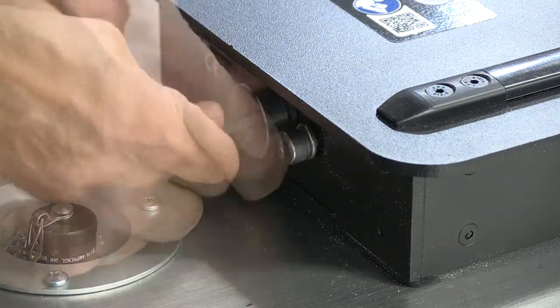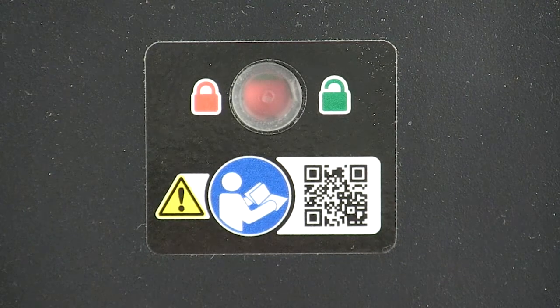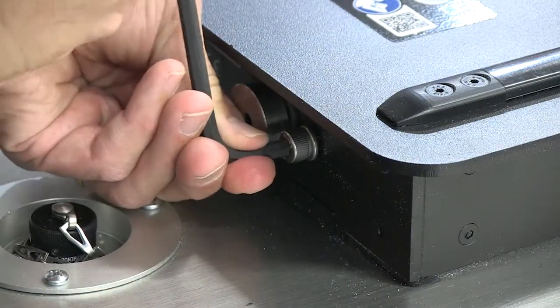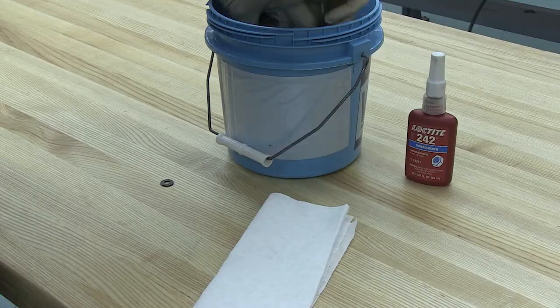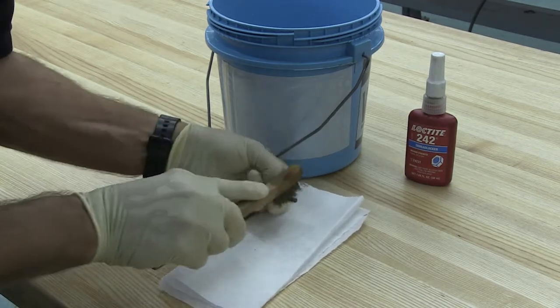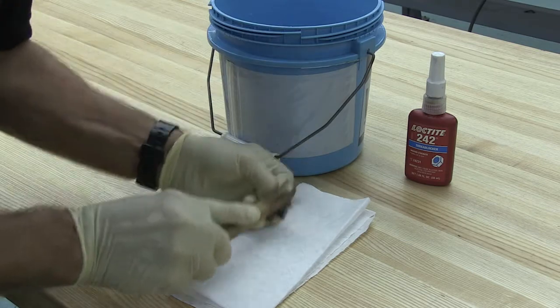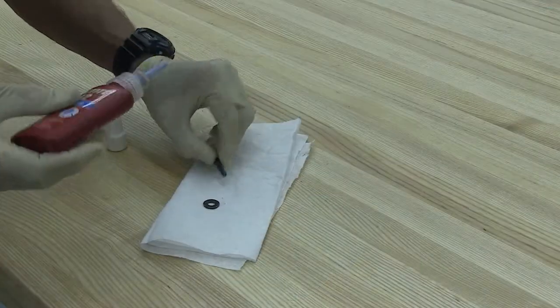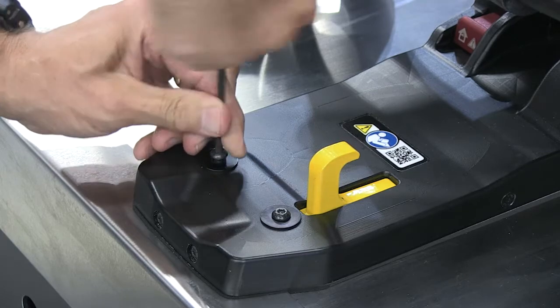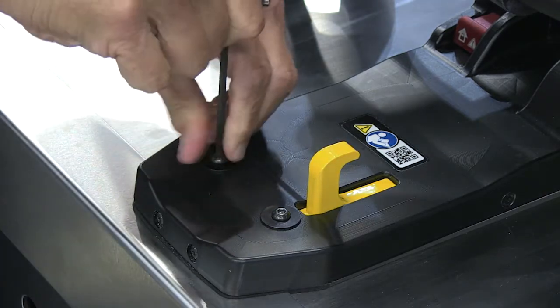Use a 6mm Allen wrench to tighten the fastening bolt. Verify the floor lock indicator window changes from green, unlocked, to fully red, locked. Use the 6mm Allen wrench to tighten the set screw until snug. Clean and prepare the two 4mm nose screws by cleaning their threads and the mating threads of the safety hook mounting block with acetone or an appropriate Loctite cleaner primer and allow the threads to dry completely. Apply one drop of threadlocker to the threads of the screws and install them immediately. Wipe off any excess threadlocker. Use a 4mm Allen wrench to attach the two nose screws and tighten until snug.